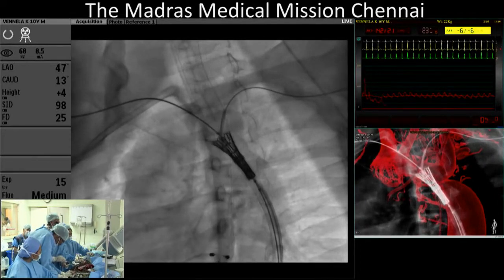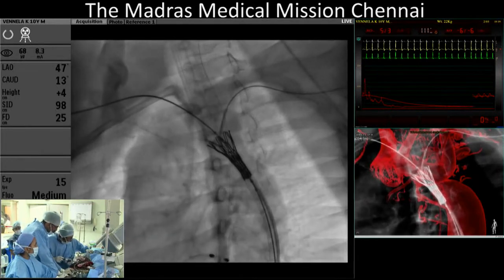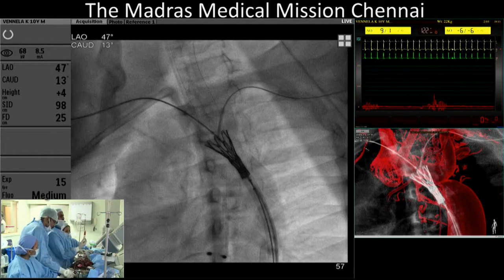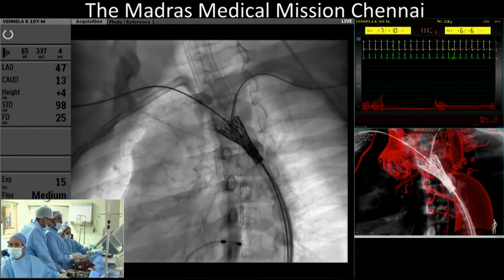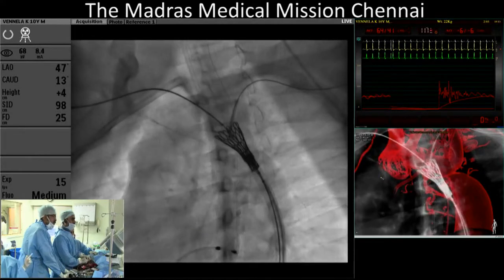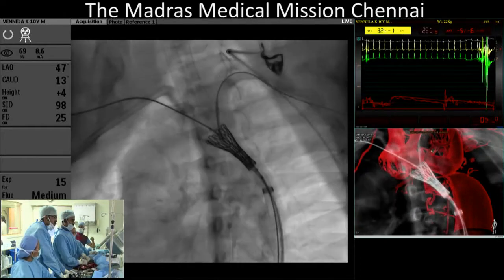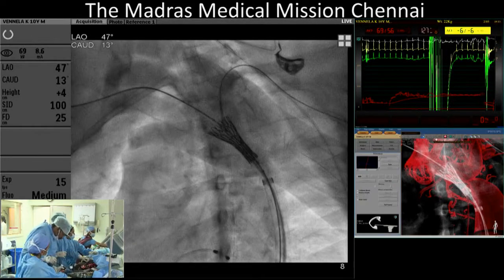Yeah, exactly. So right now I am just opening out partially. And I am making one check angiogram. We can see the coarctation part below. So I am slightly pulling it out, exposing the stent is more or less in the middle of the coarctation site. Yes? Yeah. Can you inflate? Yeah, just to take the hand up, hands up, hands up.